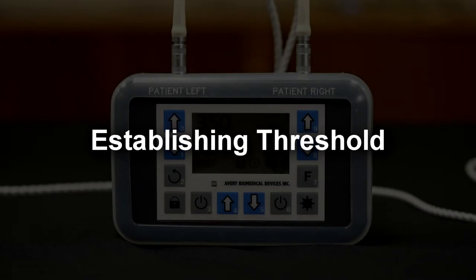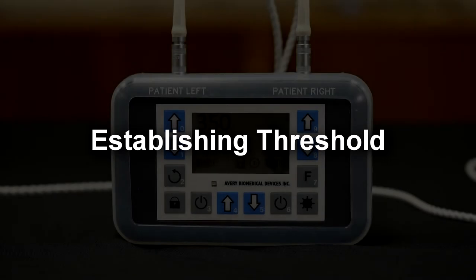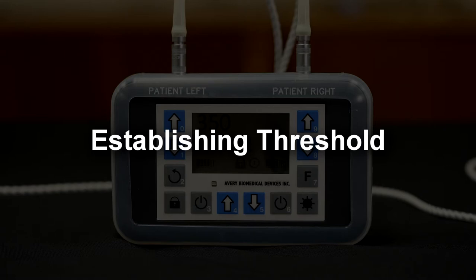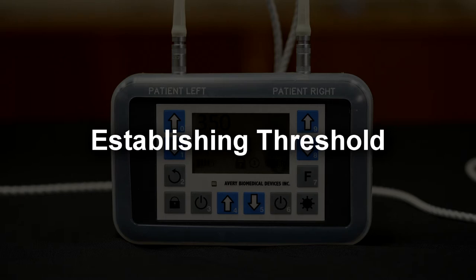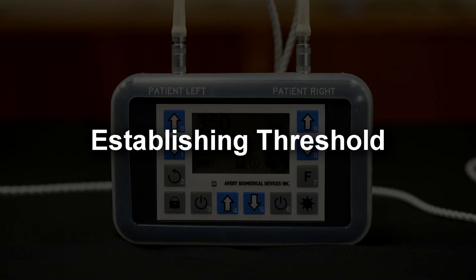Establishing Threshold. Regardless of patient diagnosis, determination of each hemidiaphragm threshold is required prior to the start of effective bilateral diaphragm pacing. Threshold is the lowest amplitude setting that causes muscular contraction. The procedure to determine threshold amplitudes is as follows.